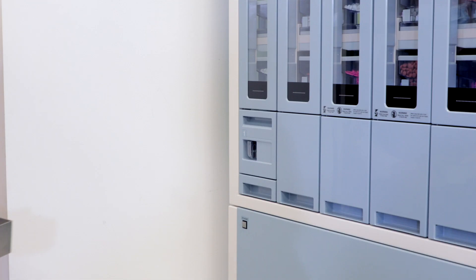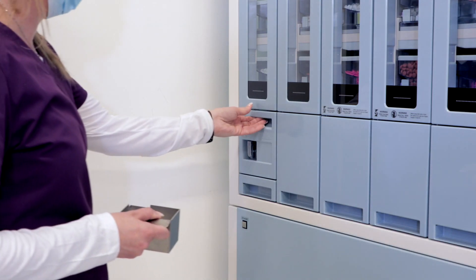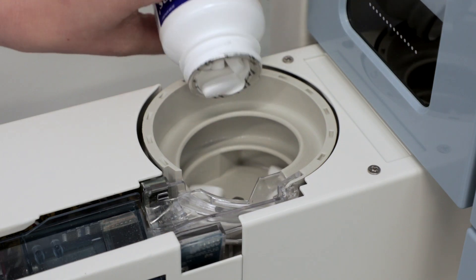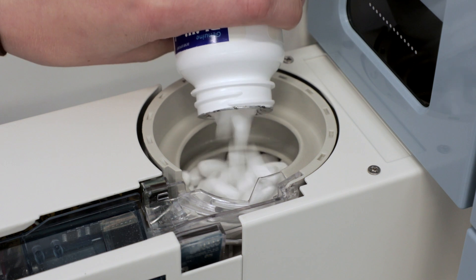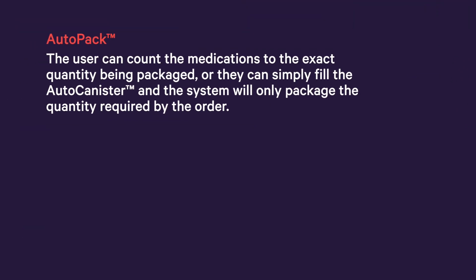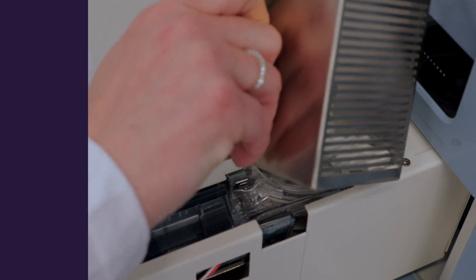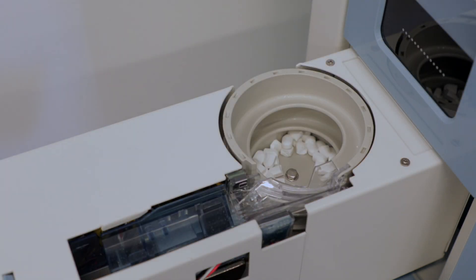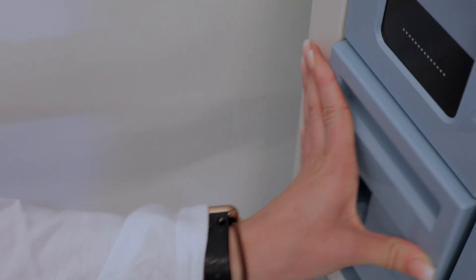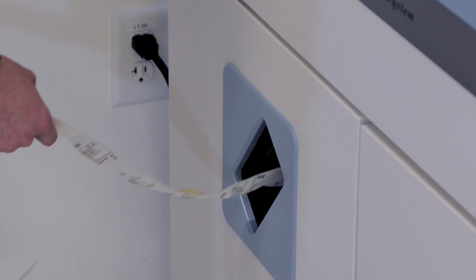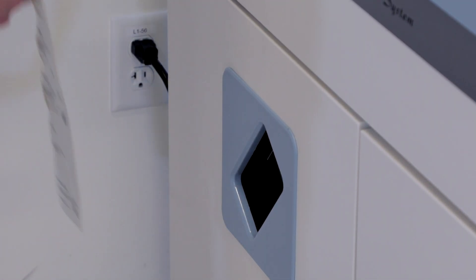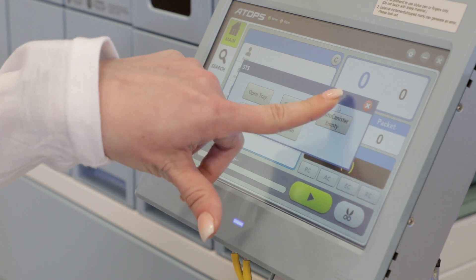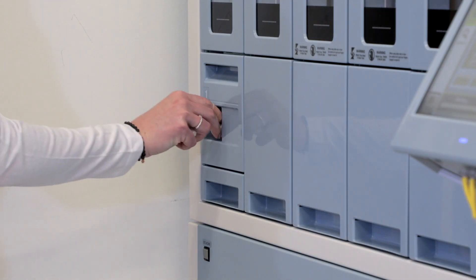The user then pulls open the drawer and loads the appropriate whole medications or half tablets. The user can count the medications to the exact quantity being packaged, or they can simply fill the AutoCanister, and the system will only package the quantity required by the order. The user closes the drawer and then completes the order from the packager. Once the medication pouches are packaged, the user can empty any excess medication and return it to the original bottle.